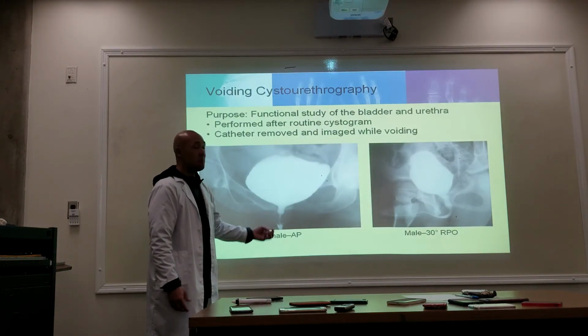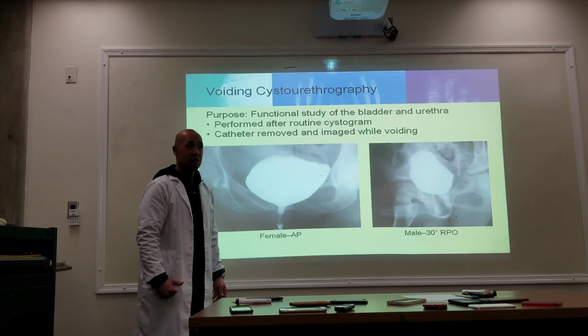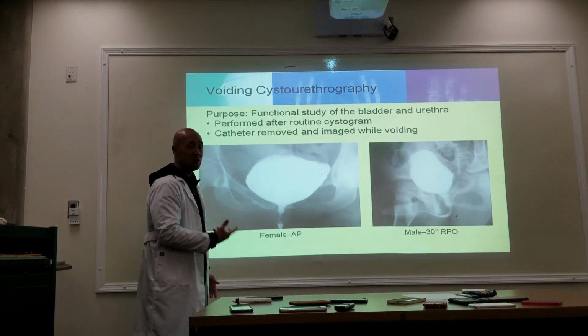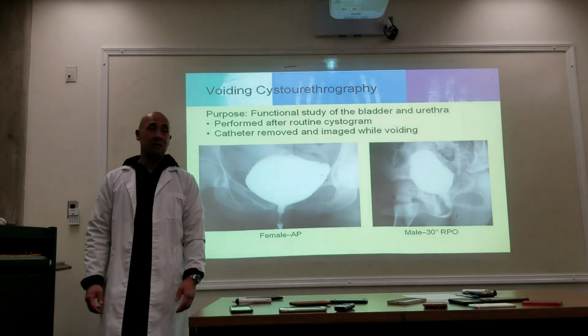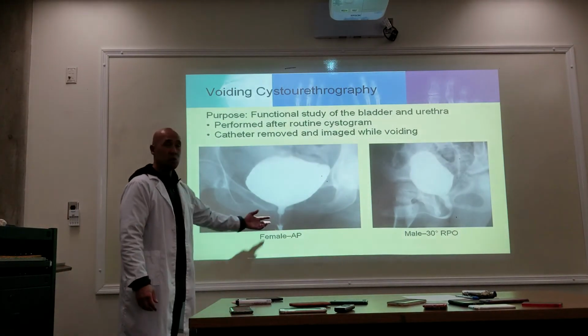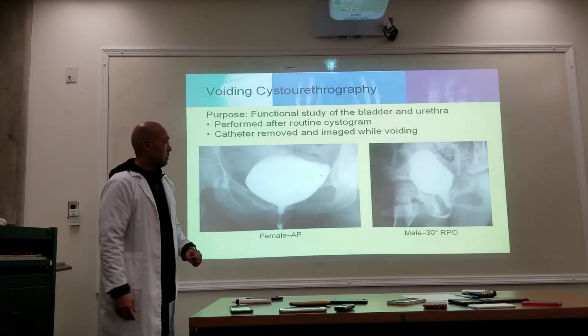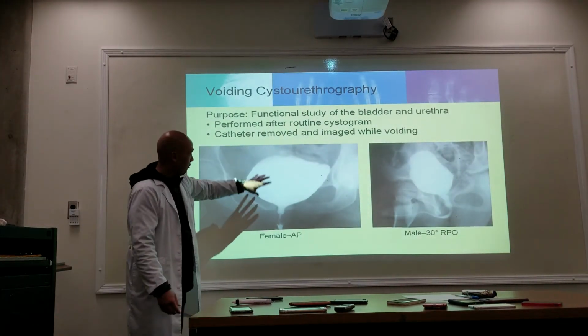And the doctor again may be taking spot films, because that's a quick way of doing it. They may take spot films, or you may be taking these X-rays as they void, one or two shots. Now with males, so one view for voiding for females.